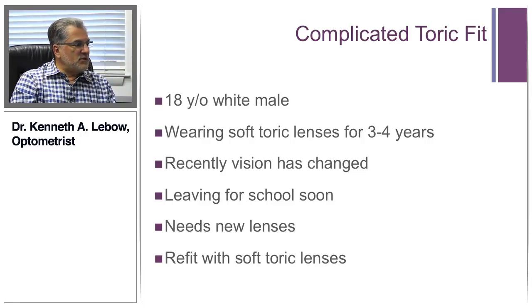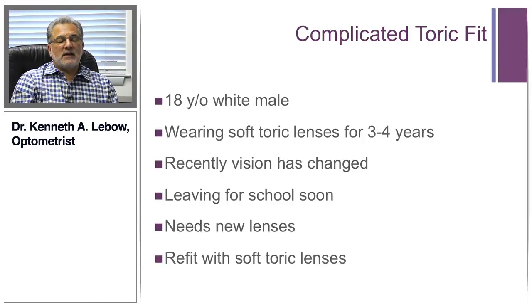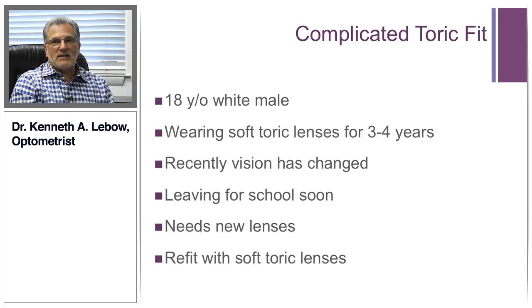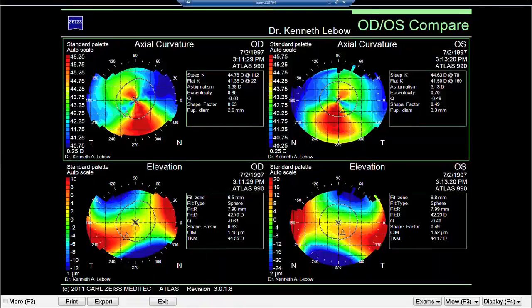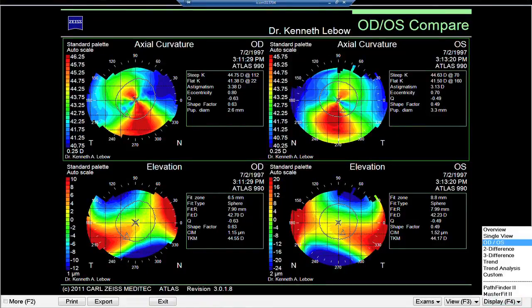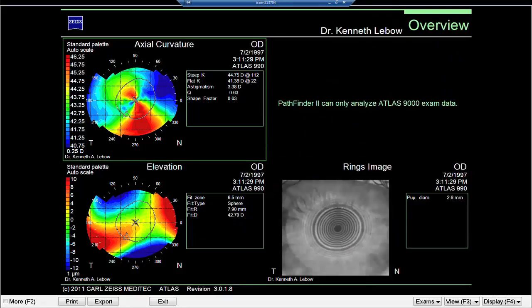But if you look at these images and you have good pattern recognition, you should be slightly aware that maybe they're not exactly what they represent. Going to the overview map for the right eye, the Pathfinder data is missing because we had to import the data. But one thing to pay attention to is the shape factor, which was 0.63 — that should raise some suspicion that maybe this is not a completely normal eye, regardless of what the computer generates.